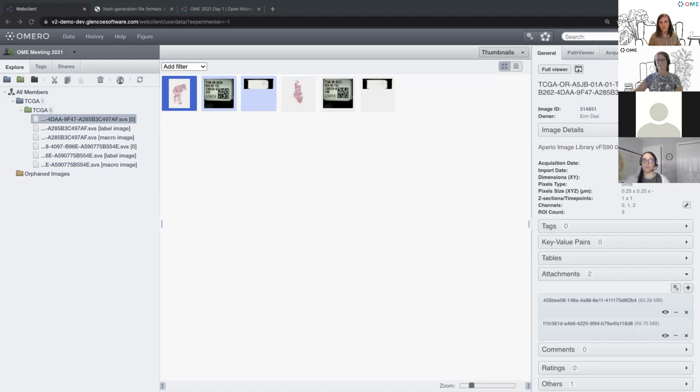So you'll see it in PathViewer today and some of the workflows that we've built into both OMERO and PathViewer. But we're happy to talk about across this meeting other ways, and I'm sure the OME team will be as well, other ways to build visualizations like these.